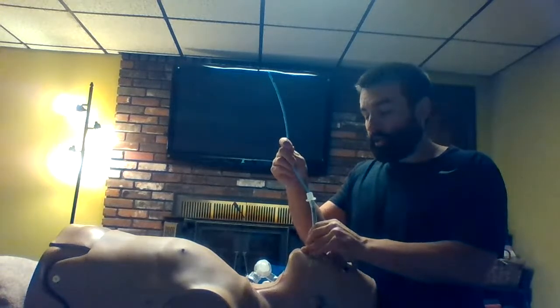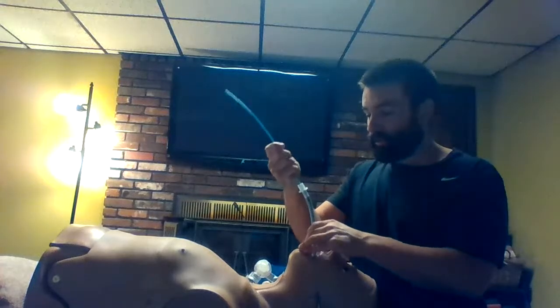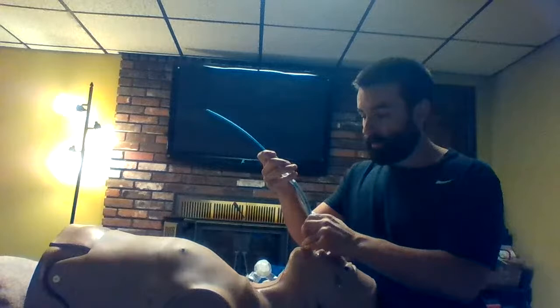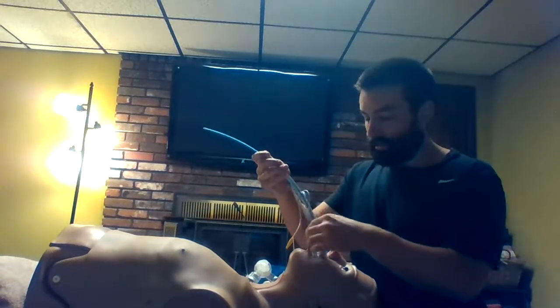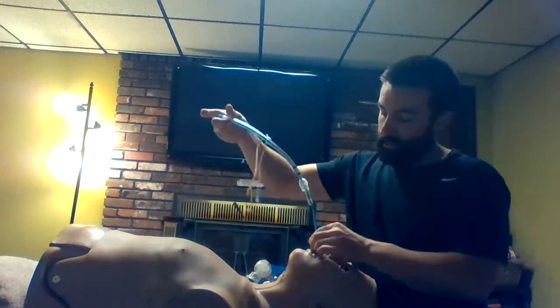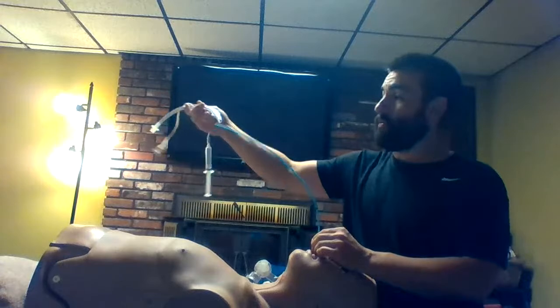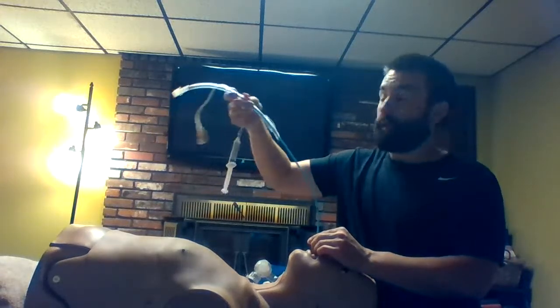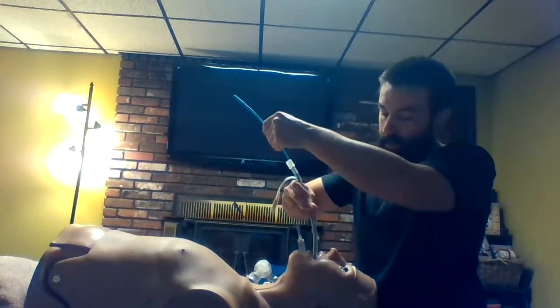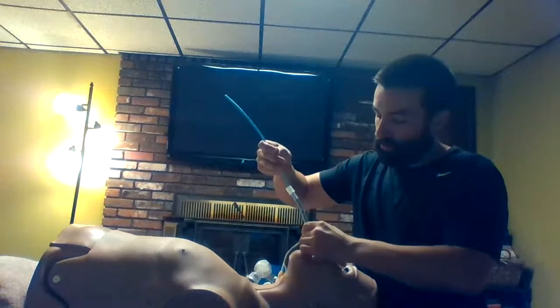So usually you'll have somebody hold this kind of firmly and keep that in place while you're trying to pull this tube out, okay? And we're just slowly sliding this thing up and out. All right, this is where it gets tough. Somebody's having to hold it in. Okay, the properly lubed and checked tube will be slid down. And then all we're trying to do is slide this back to where that tube kind of resided before. Okay, so somebody's holding this really, really well.